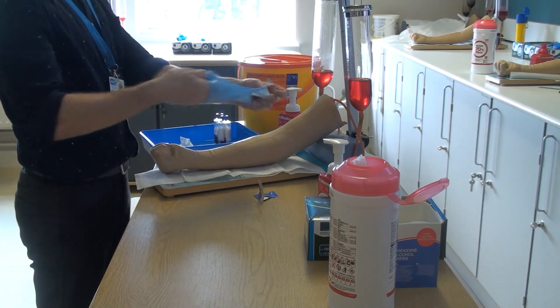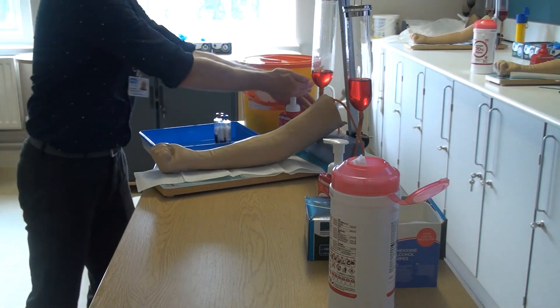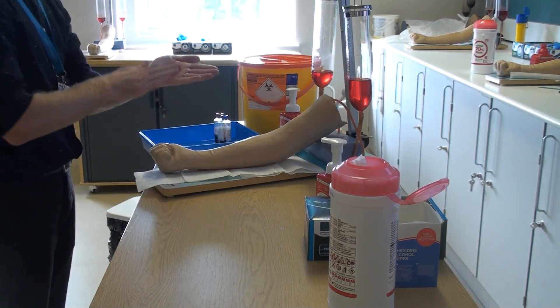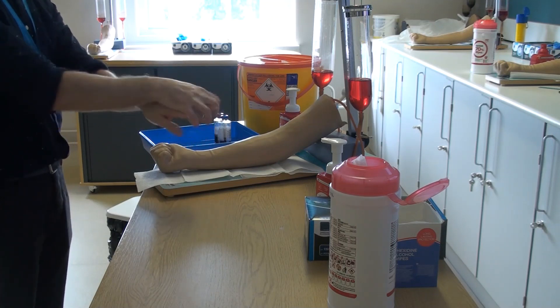Once complete, remove all PPE and packaging from the area and dispose in the clinical waste. Decontaminate your hands a final time before leaving the patient's bedside and sending the samples to the laboratory as soon as possible.